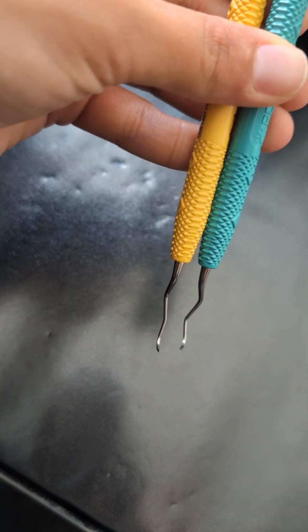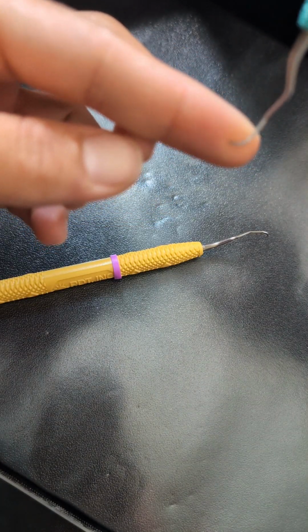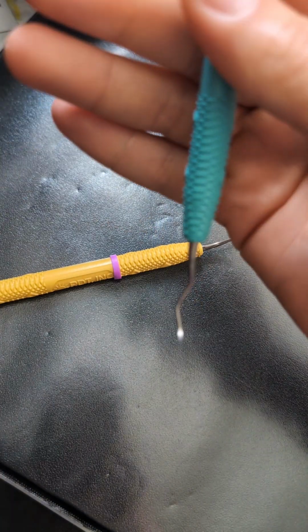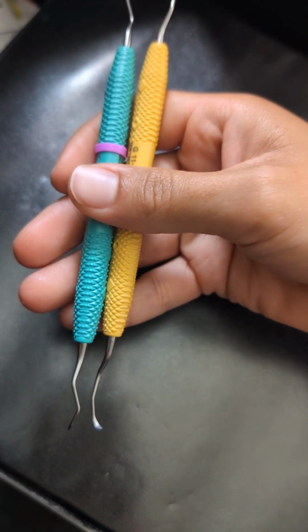Another difference is that these instruments have only one cutting edge, which is the lower cutting edge. One side is lower than the other one, so the one that is lower, that's the one that we are going to use toward the tooth surface. And for the universal, it was two cutting edges. But these instruments are also used for supragingival and subgingival calculus removal. And they also have a rounded toe, indicating that they are used subgingival.